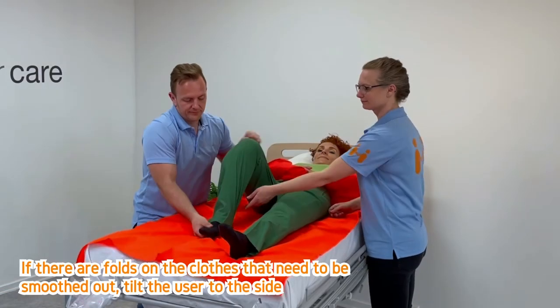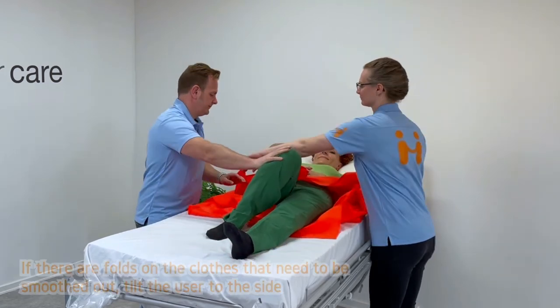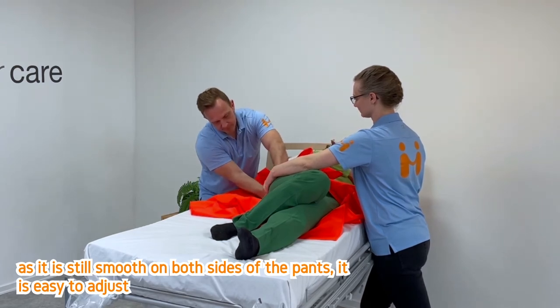If there are any folds on the clothes that need to be smoothed out, tilt the user to the side. As it is still smooth on both sides of the pants, it's easy to adjust.